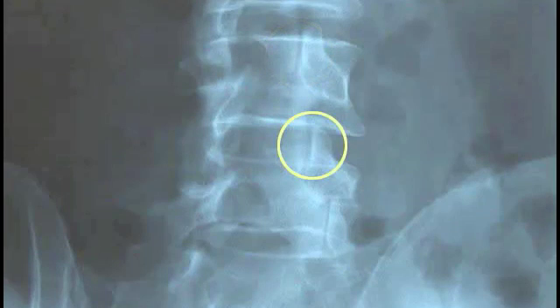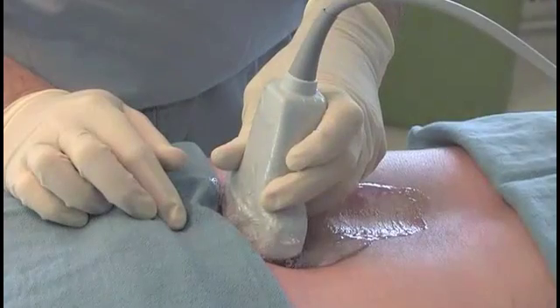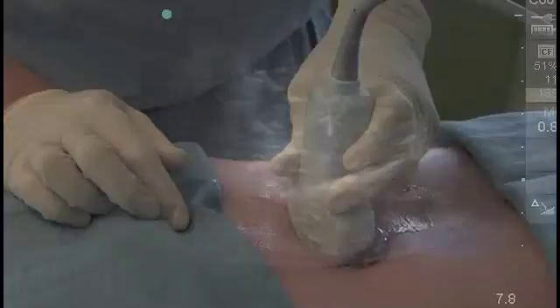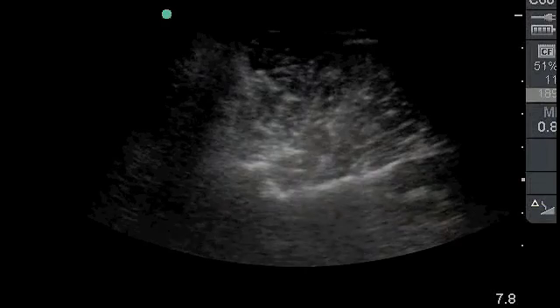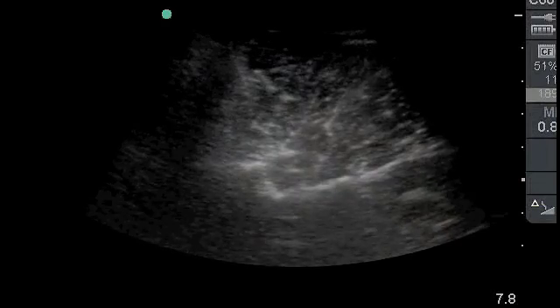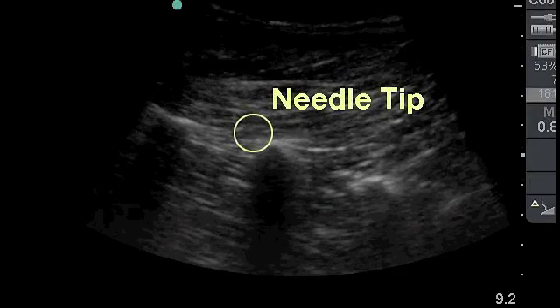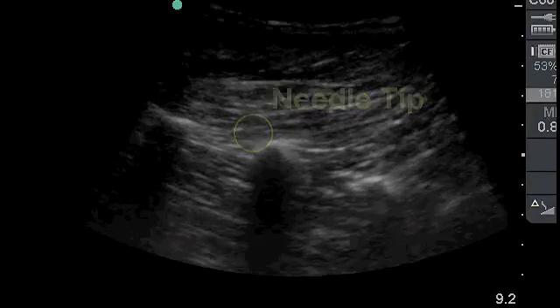In your patient with low back pain, the right L3-L4 and L4-L5 zygapophyseal joints are suspected as the sources of pain. Using ultrasound, you are easily able to identify these target lumbar segments. For each of the four required injections, the spinal needle is visualized as it crosses the ultrasound beam and makes contact with the bone, and you are able to adequately visualize the needle at the cephalad margin of the transverse process. The patient tolerates the procedure well and returns home to monitor the intensity of his back pain.